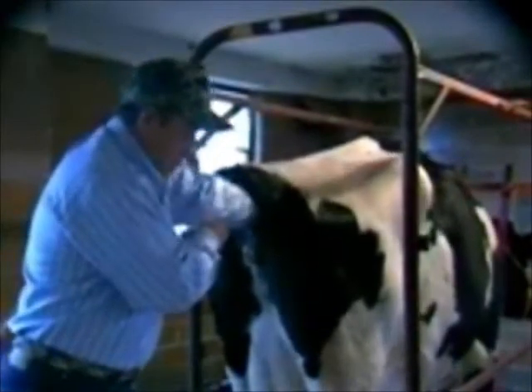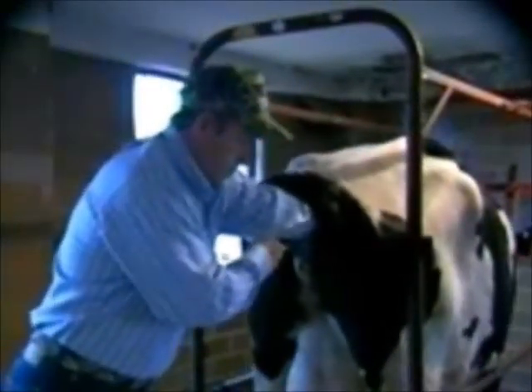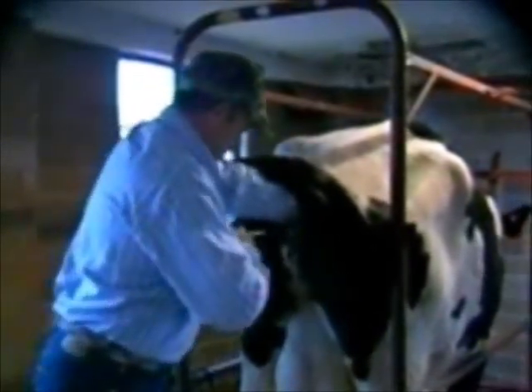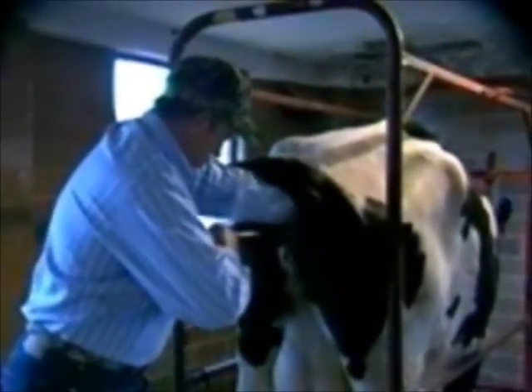One must be careful to angle the AI gun up to avoid the suburethral diverticulum. When he's AI-ing, what he's actually doing is hanging onto the cervix and closing off the fornix vagina, to try to close off the fornix area and then pushing his way through the cervical rings. The semen is then gently placed into the uterine body, which is the target site for doing all the cervical AI of beef cattle and dairy cattle.